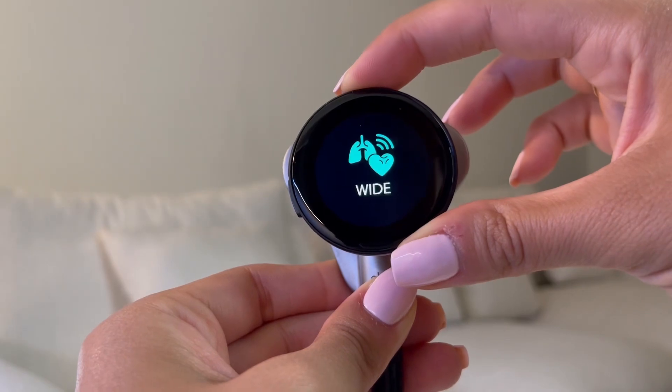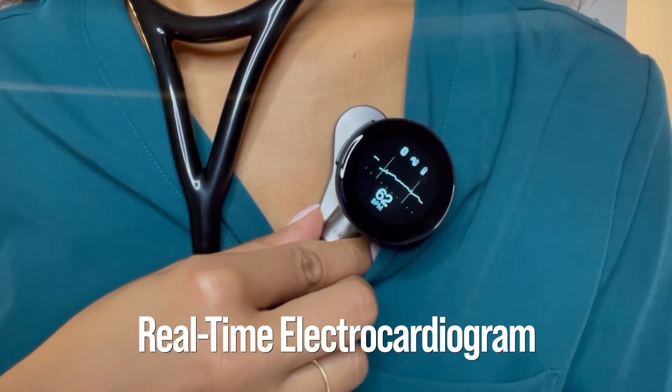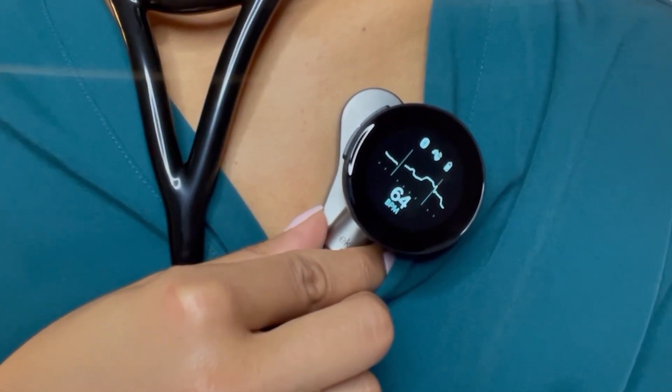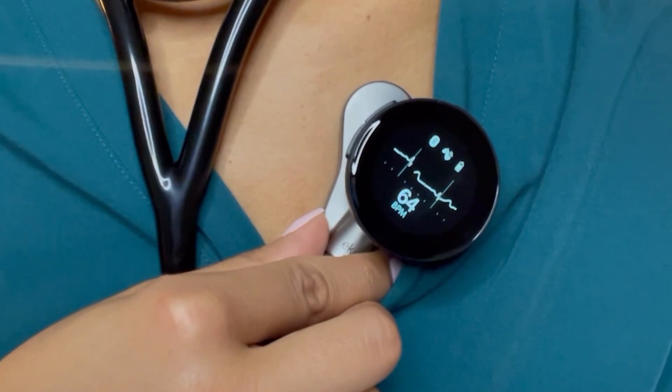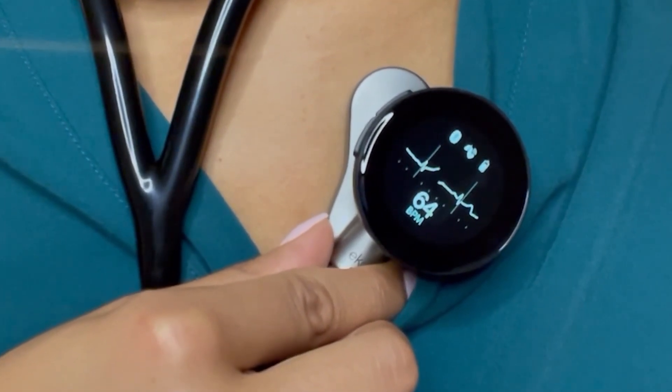Another remarkable feature of the Echocore 500 is the EKG Live. Yes, you heard that right — the EKG right on your stethoscope. At the press of a button, the EKG Live feature allows you to capture a real-time electrocardiogram alongside the heart sounds. This simultaneous display of heart sounds and EKG tracings provides a comprehensive picture of your patient's cardiac health.